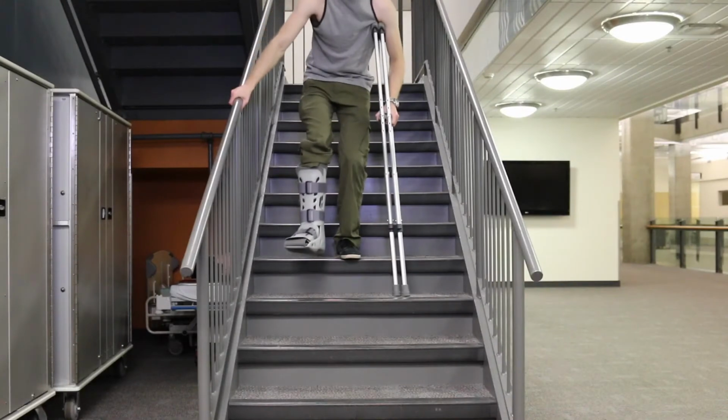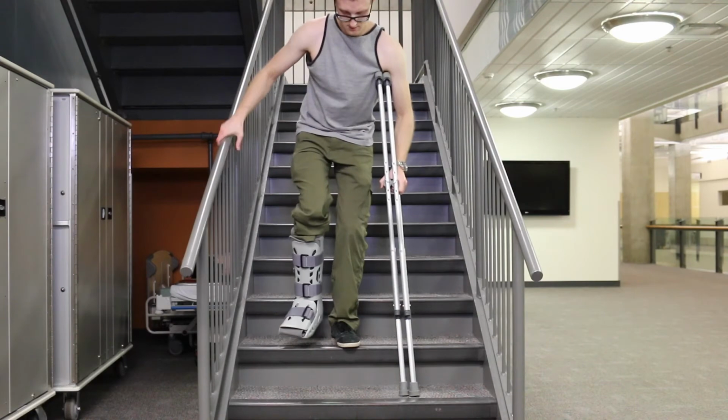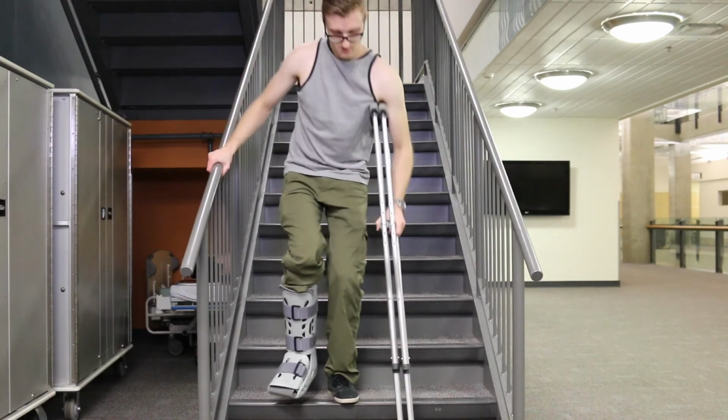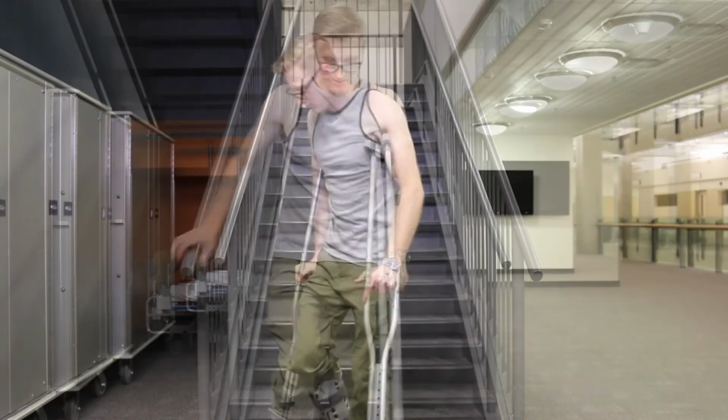When going down, you will lower the crutches onto the lower step, slide your hand down the rail, lower the injured leg down to the same step the crutch is on, and then hop down with the good leg.